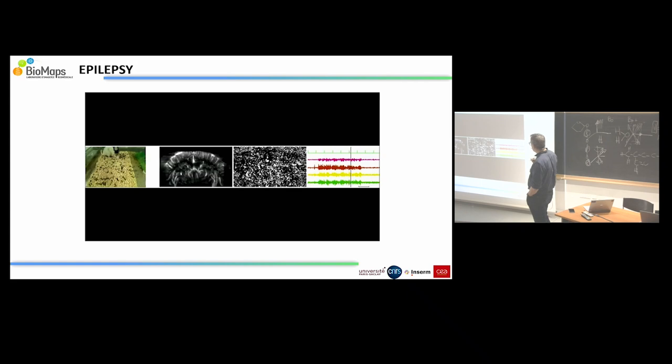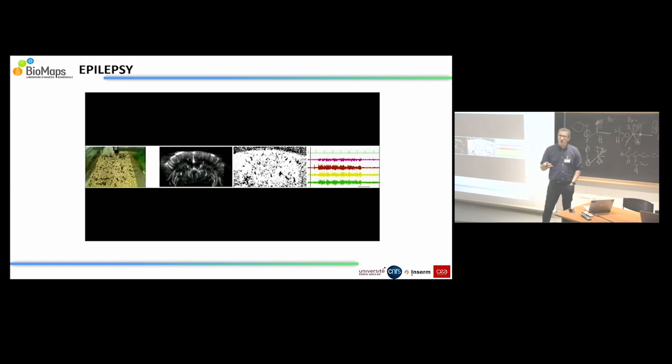And just before the end, you will see the hippocampus will perfuse again a lot. Then he lost everything. And it will come back to normal just after that. Okay. So this is a new way to see how the brain behaves during this kind of seizure or this kind of pathology.